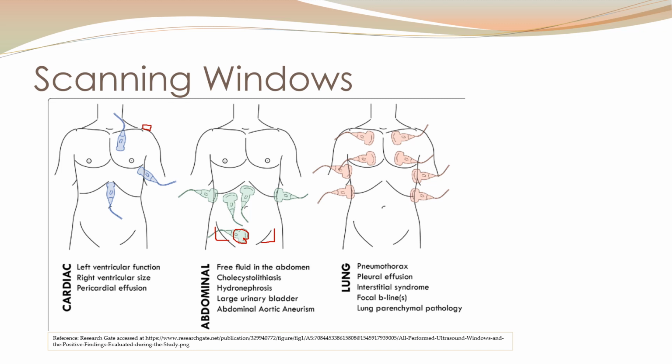And when we show these windows, it really isn't just this one spot. You'd be adjusting this transducer forward around that inferior rib margin, possibly onto the patient's back if you had them roll into a lateral decubitus position. So it gives you tons of different options, and these are just some of the places you look. Nothing's really off limits. You do notice that they don't point out any windows right in this region, and that's because that descending colon really holds a lot of gas and can be really frustrating to try and work around.